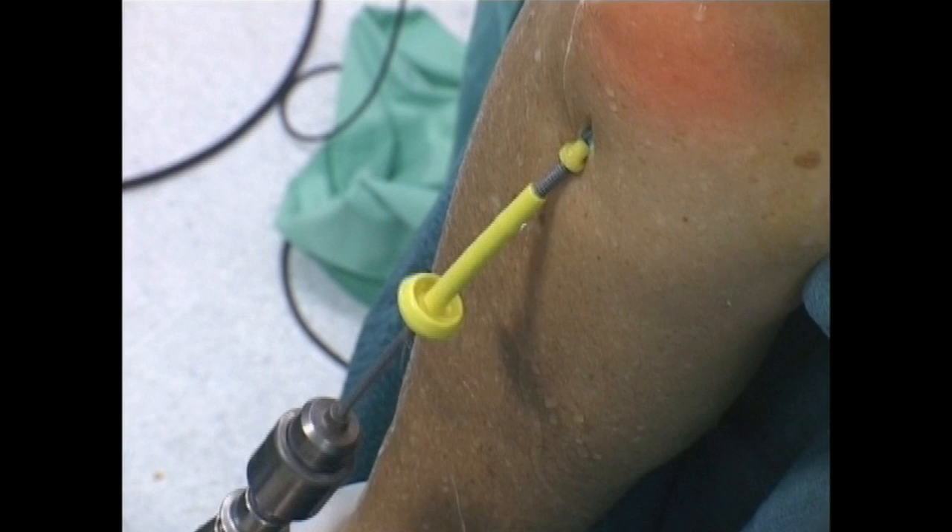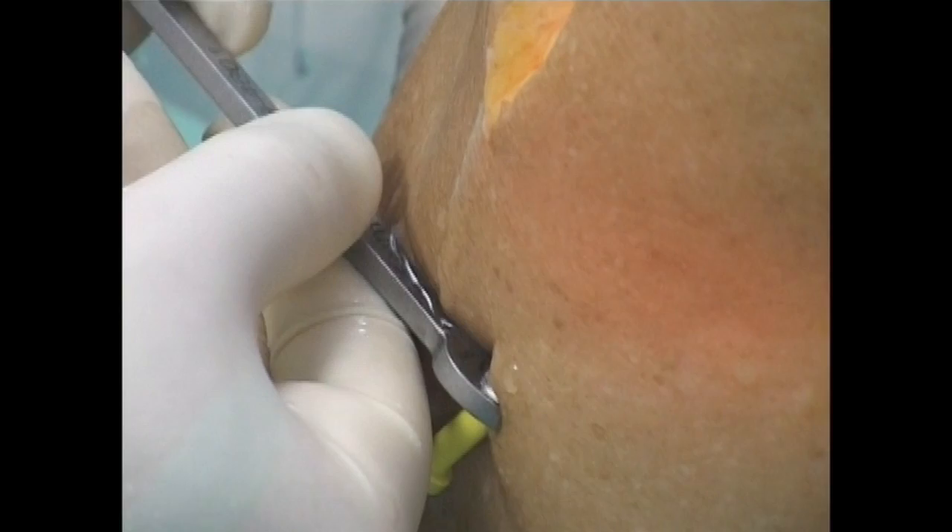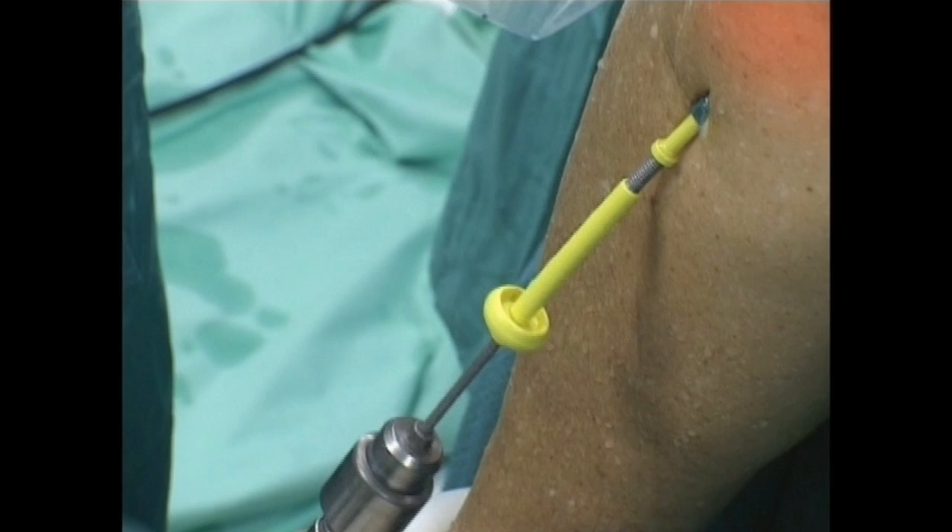Using a high-speed drill, initial counterclockwise rotation ensures an even cutting engagement into the plateau. Preparation of the tibial implant bed through clockwise rotation is completed when the cutting blade reaches the proximal end of the blade stop. With the cutting blade still in place, the appropriate sized sizing trial is inserted. Confirm anterior, posterior and medial lateral positioning. If the trial is proud at the margins, it can be lowered by adjusting the blade stop clockwise with a wrench. A 90 degree turn lowers the blade stop and implant floor by one millimetre after re-reaming.